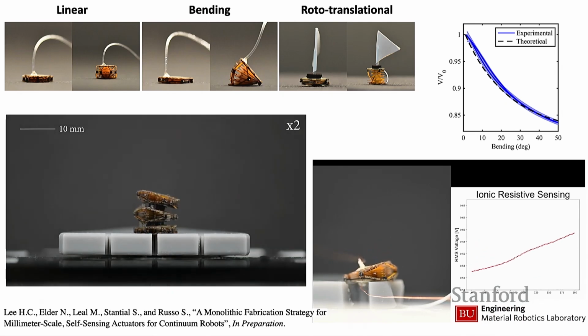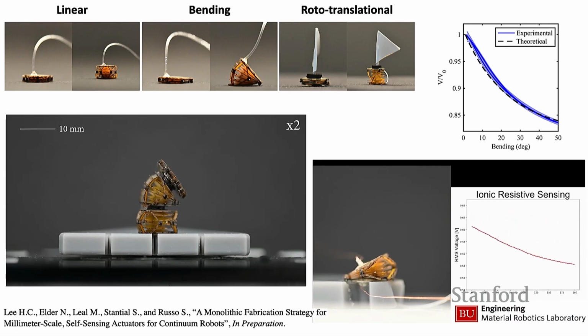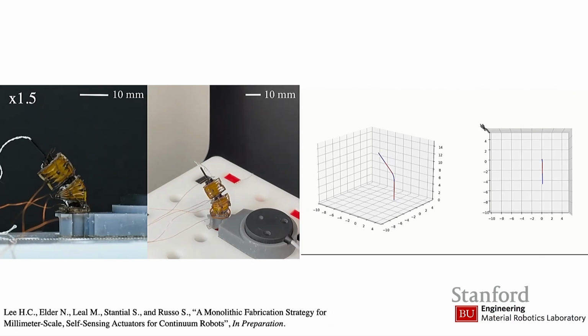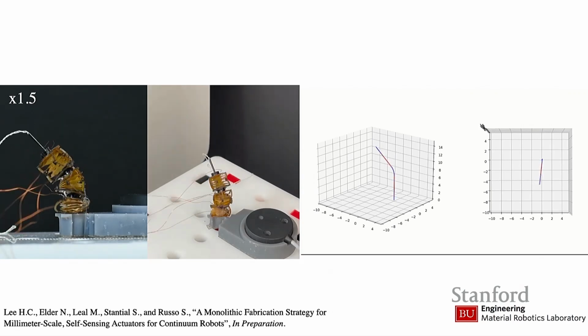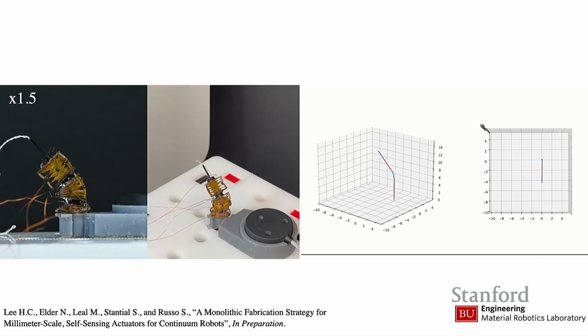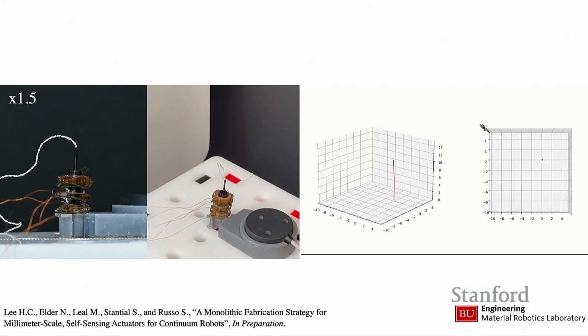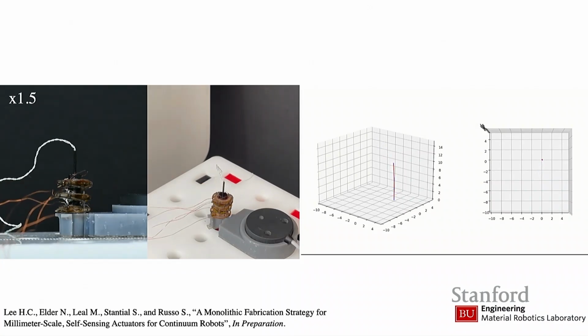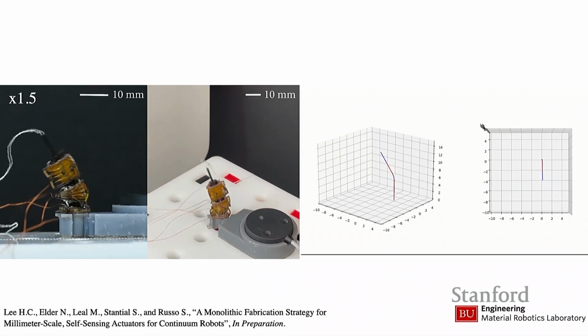And because these are, again, hybrid robots, we can use the benefits of both worlds. And so this goes back into basically having rigid robots, and we all know how to predict the motion of rigid robots and model them, right? And so when we are able to do that, we can track and predict their position. We have sensors embedded that return every type of information we need to know about where the robot is in space, how it is moving, and so on.